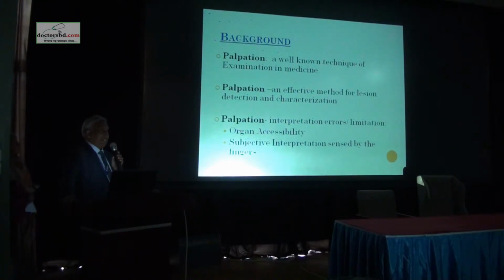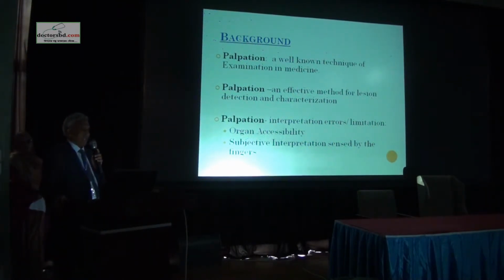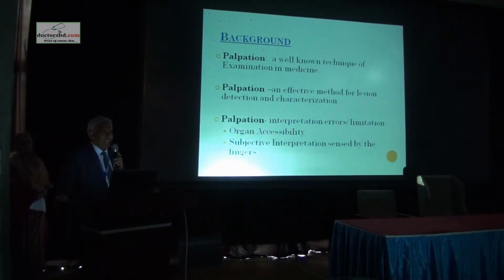In medicine, in clinical practice, palpation is a well-known technique of examination. For any lesion, you need to do examination by palpation to detect and characterize the lesion. But there are fallacies, some limitations of those age-old techniques.